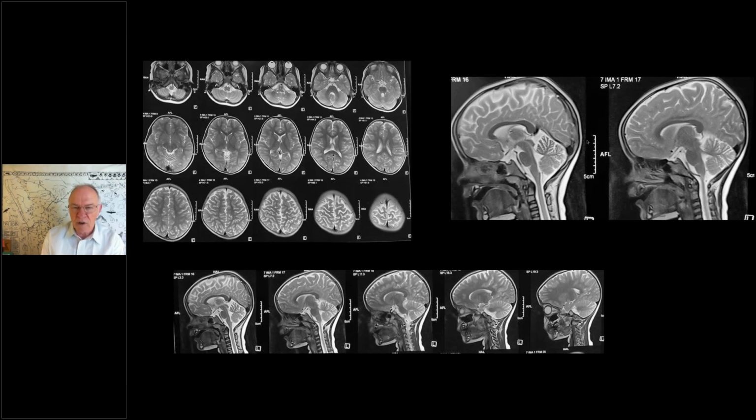In that situation you have hypointense stripes in the brainstem on FLAIR and T2. But as a rule, Friedreich ataxia, which goes along with cervical cord thinning, initially has a normal cerebellum, so this image is not compatible with early-stage Friedreich ataxia in my mind. And in ARSACS you would have those pontine stripes, the tiger stripe pattern? Yeah, that's missing.